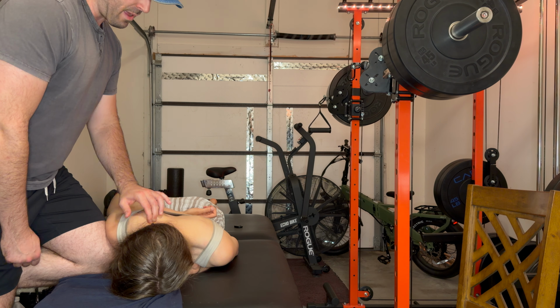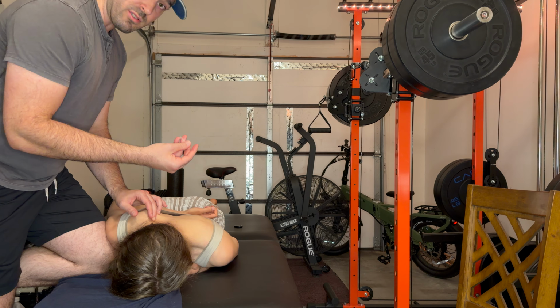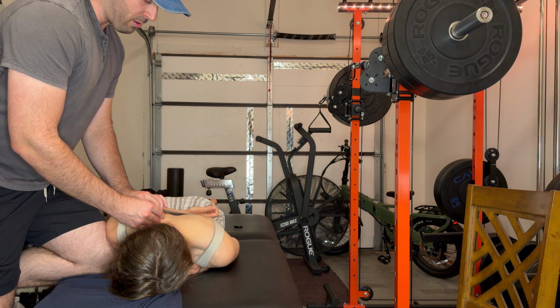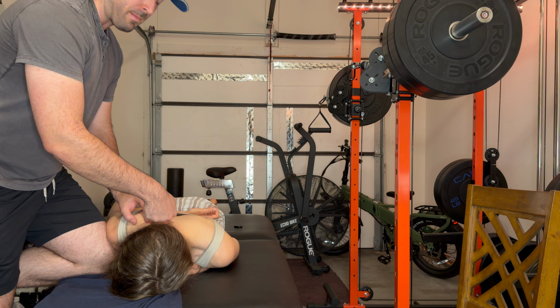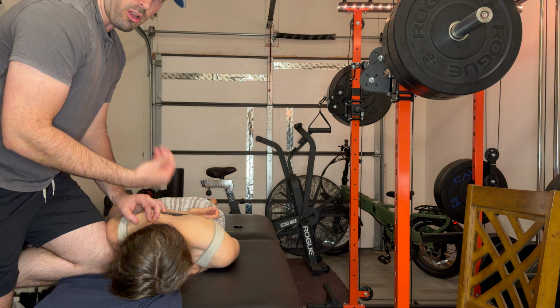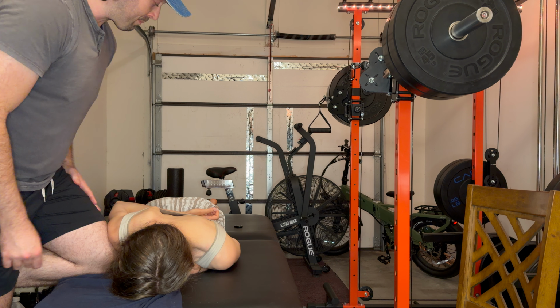From here, I'm going to find that superior medial border, and we're going to do another very safe but very shallow technique. I like to find where the bony border is, and then once I'm here, I insert there, and fiber direction and needle direction is towards the scapula. We're not needling straight down here because again, the lung field is there. We don't want to cause any pneumothorax. But these are the favorite ways that I like to needle the levator scapula.